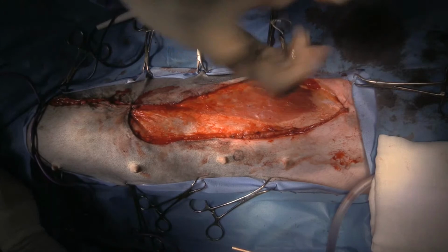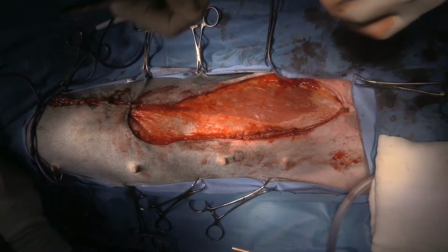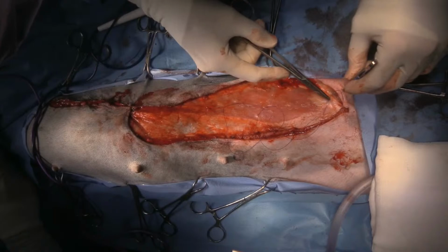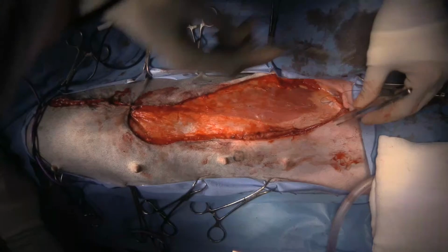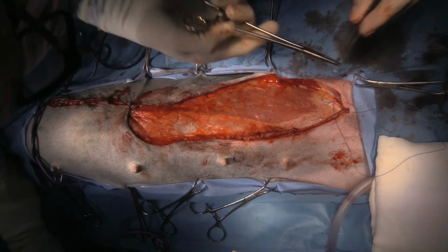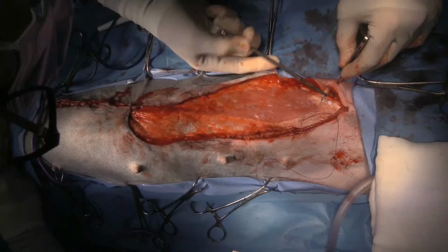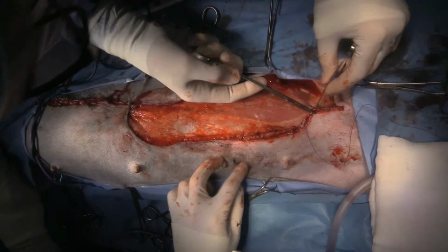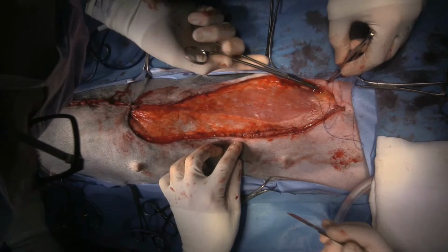So there's a comment about undermining the skin, and that's certainly something that we could do. I don't love undermining, especially with cancer surgery, because you have potential to release cancer cells further away from your incision, although I feel very confident in this case that we've gotten it all. So you're happy with just around the circle? So about a centimeter around that circle. So you can use the Sharpie if you'd like to redraw a margin.